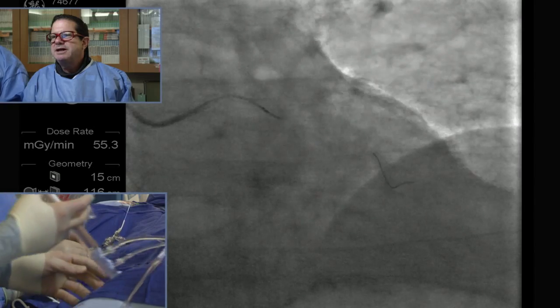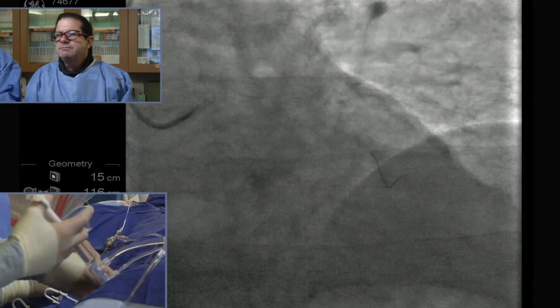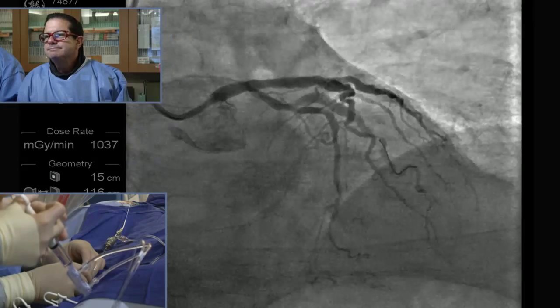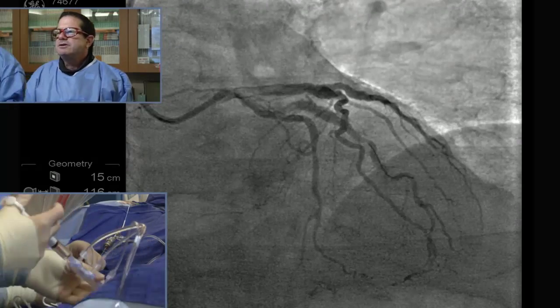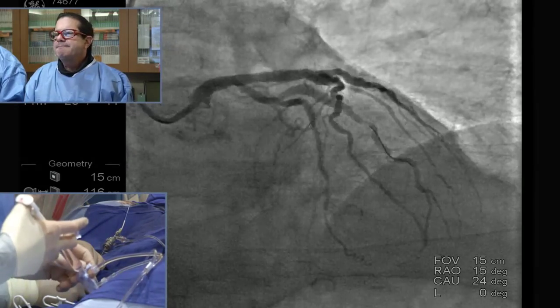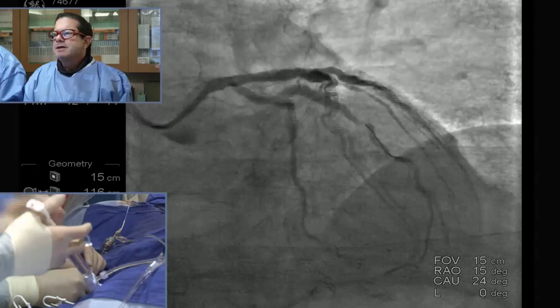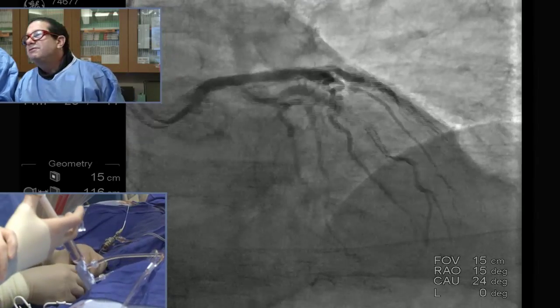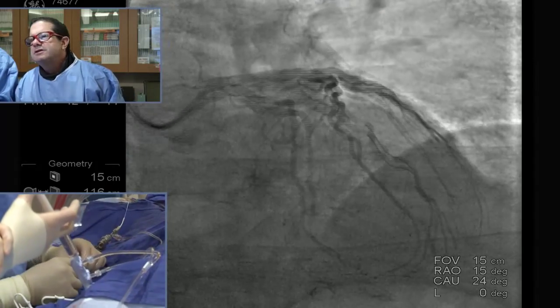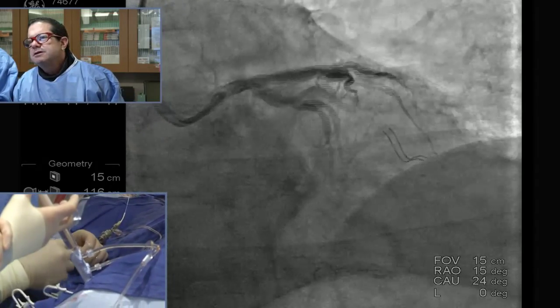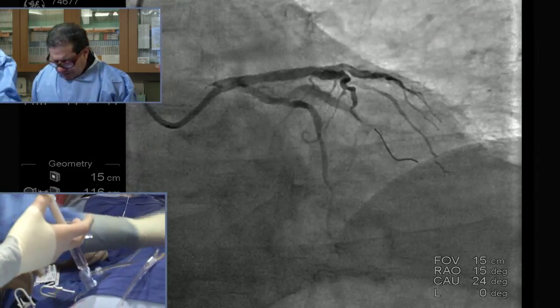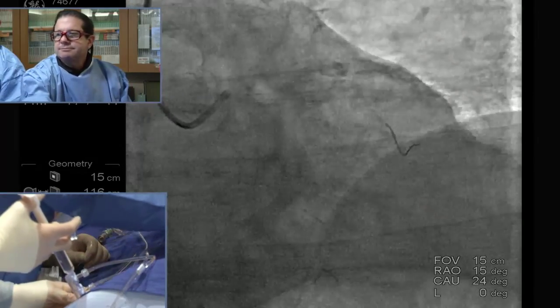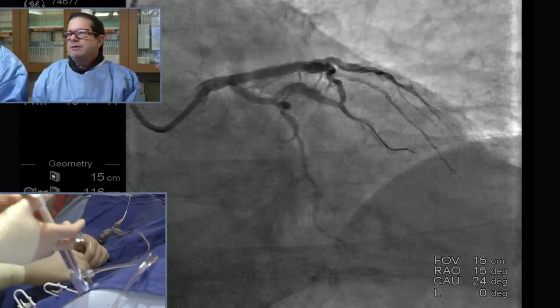Let's take this back now and do the same picture and make sure we're okay. So that's another lesion there — top your wire. Now, what about that other lesion? There are lesions everywhere I look in this case. There really is a big vessel down there, isn't it? I don't think I appreciated earlier how big that distal territory was.